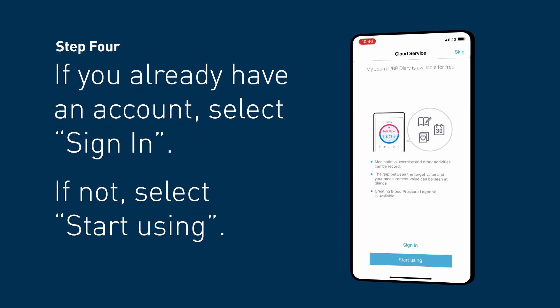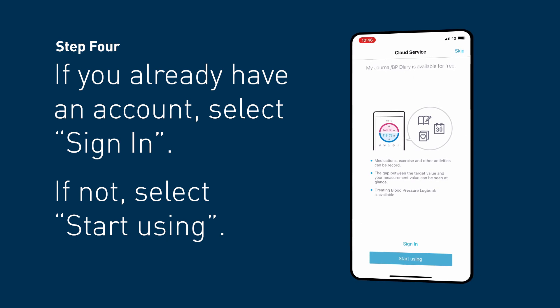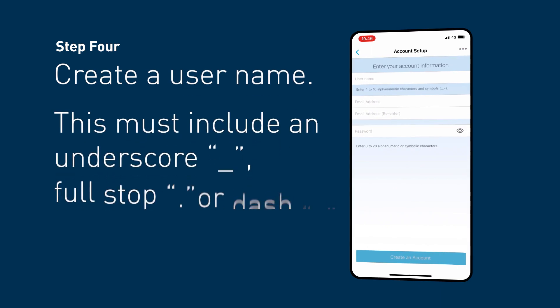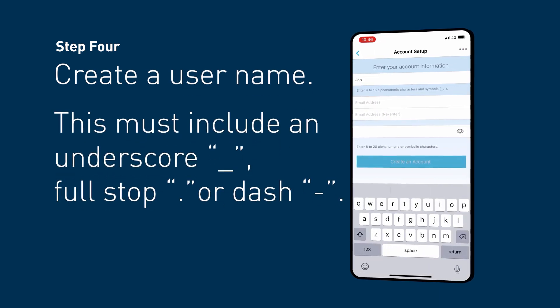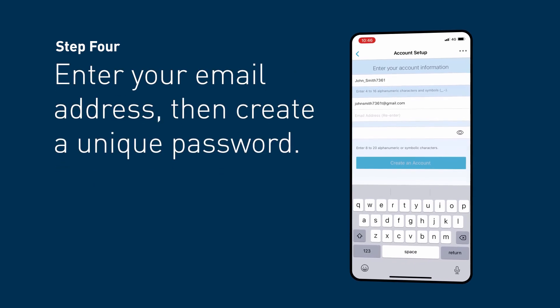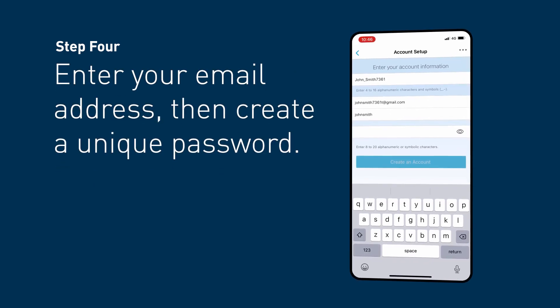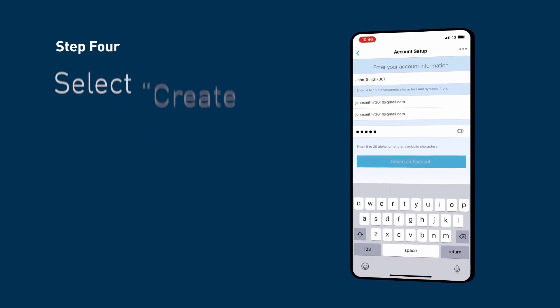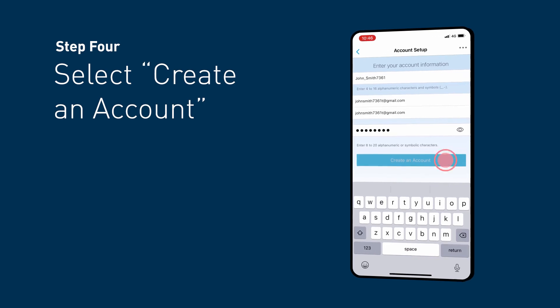Step 4. You will be prompted to go to the cloud service. If you do not have an OMRON Connect account, select Start Using. To set up your account, create a username. Please note that your username must contain an underscore, full stop, or dash. Enter your email address and create a password that is 8 to 20 alphanumeric or symbolic characters.